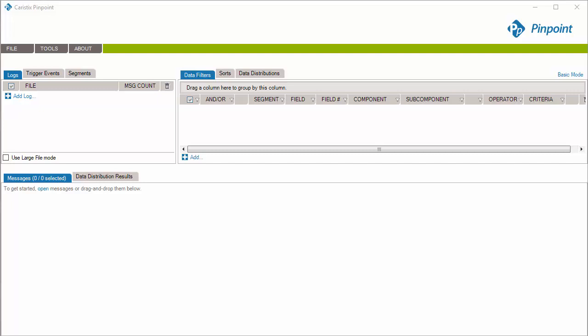First, let's open a few message files. Just drag and drop in the application.